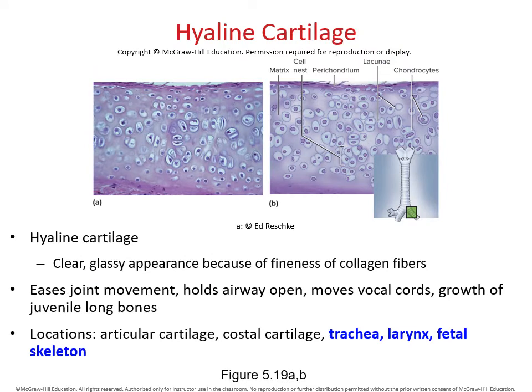All right, so let's take a look now at the hyaline cartilages. Remember, the cartilages will have very few, if any, blood vessels. They're also going to look very different because they'll have a thicker matrix, and in the matrix itself, we're going to see lots of chondrocytes. The chondrocytes are the cell types that we will find in the cartilages, and they're going to be housed in what we like to call a lacunae, a little dip.